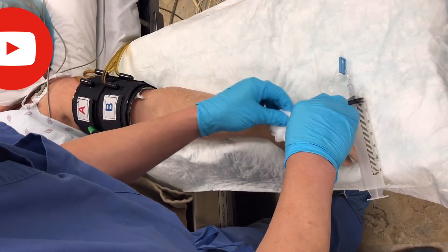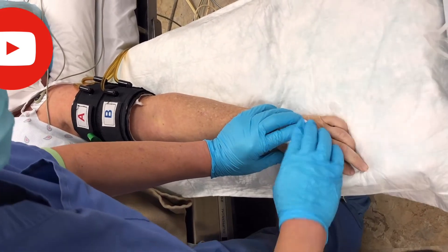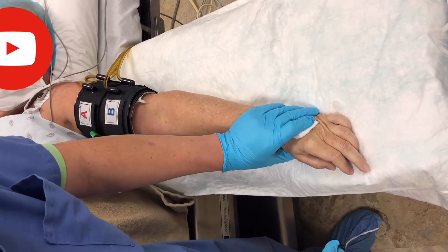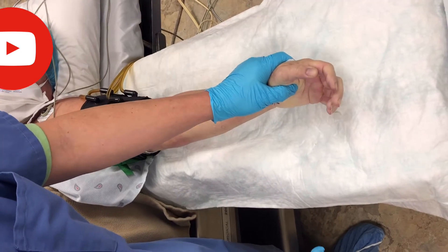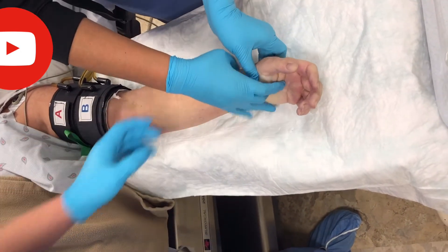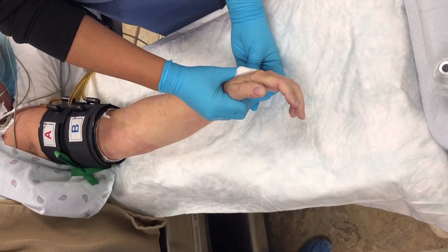Use a four-by-four or two-by-two gauze and then remove the IV and apply pressure. Now the nurse can scrub the hand to get ready for surgery.